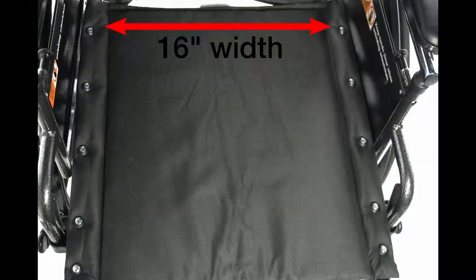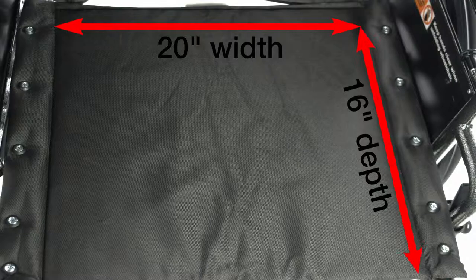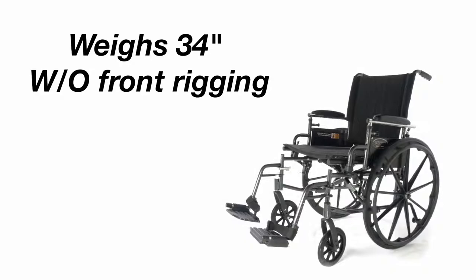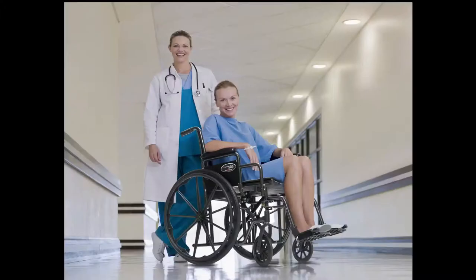Adjustable anti-tippers are a standard feature. Models are available in 16, 18, and 20-inch widths with 16-inch depth. Some models feature an 18-inch depth. It weighs less than 34 pounds without front rigging.